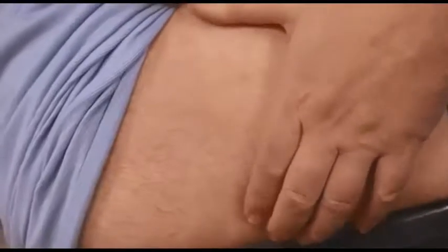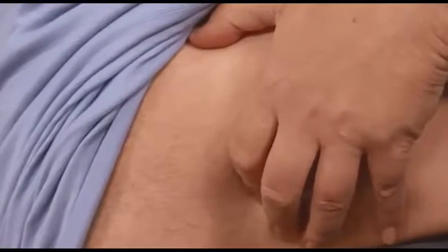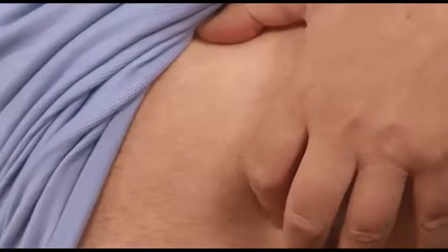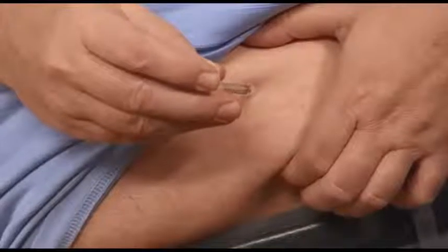Next, using your thumb and other fingers, gently, not too tight, pinch up the area of skin that you just cleaned. Pinching up helps to ensure the needle doesn't hit any muscle and that the insulin is released into the fatty tissue just beneath the skin. Now, in the middle of the pinch, insert the needle straight in. If you're very thin, you might need to inject at a 45-degree angle, but if you're not sure, discuss it with your healthcare professional. When the needle is fully inserted, slowly push in the plunger to deliver the insulin to your body. Then release the pinch as you slowly remove the needle.